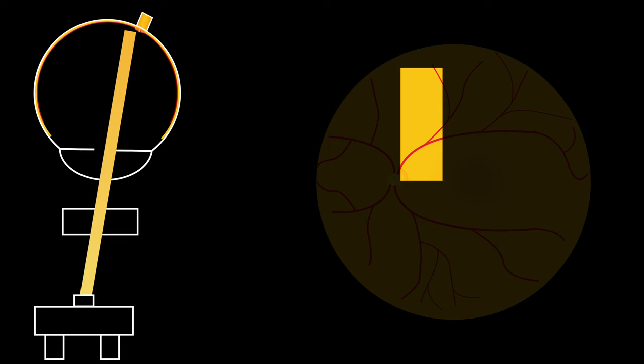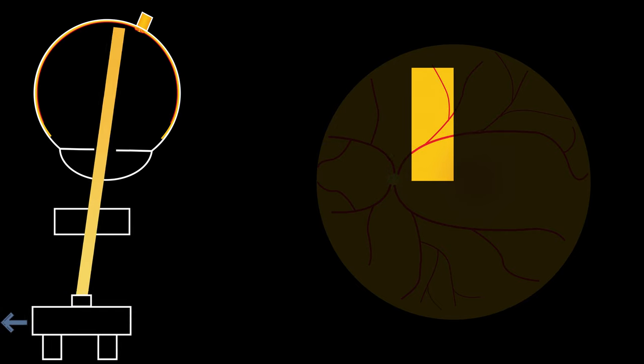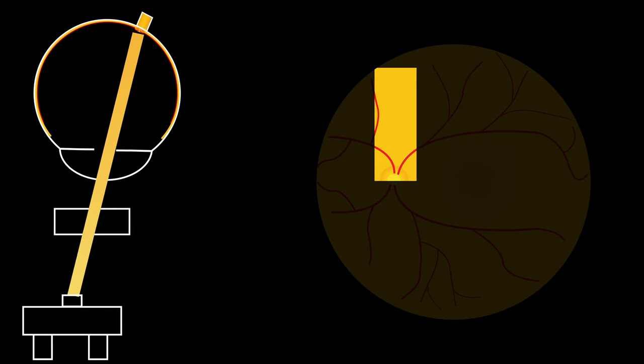Because now if we move the slit lamp again we can finally see the optic nerve but it's only visible in the lower left corner. So what do we do? We first move the lens and then move the slit lamp. And there we have it, our optic nerve. But it's not perfectly centered yet.